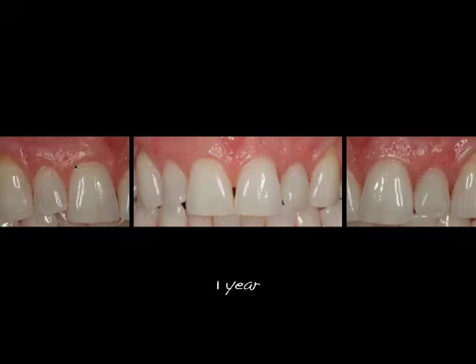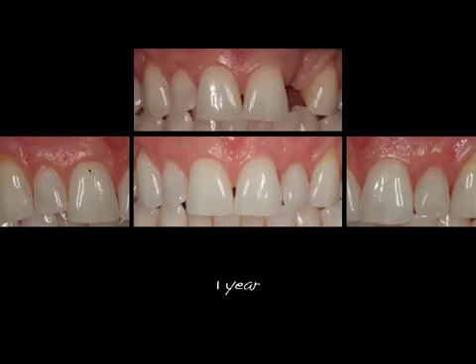All we did was we replaced the implant. We had a flap design that would give us a little bit of extra soft tissue on the facial, but we essentially did this very simply and with a result that was above average.